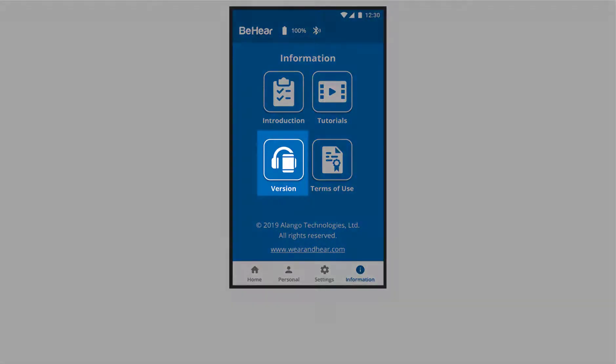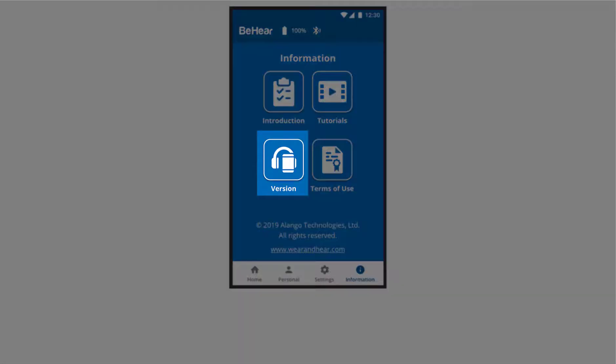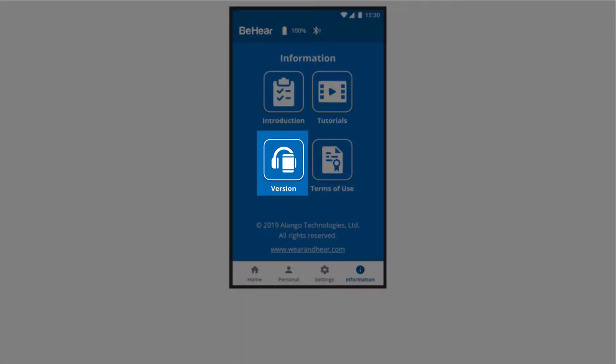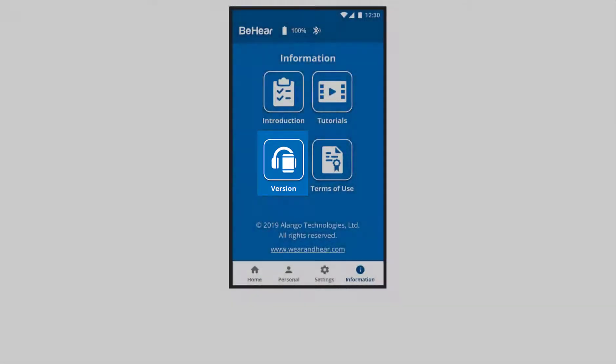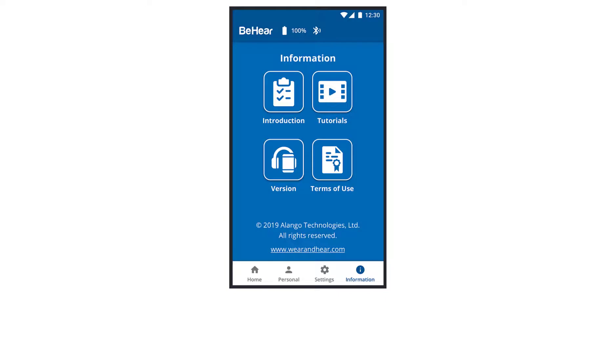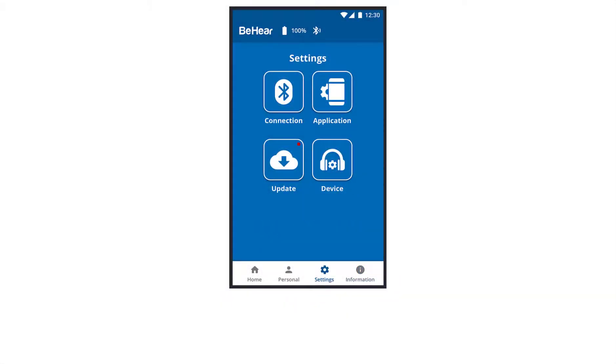Version, which is like an about screen, listing all the device info, including software and hardware versions. And terms of use. The app's settings section contains four icons.